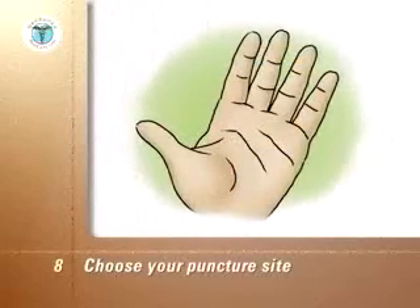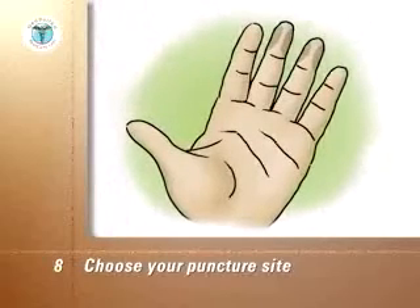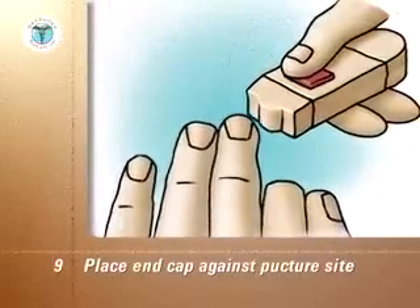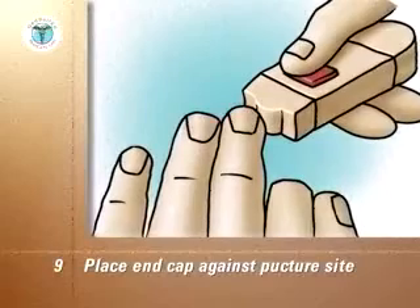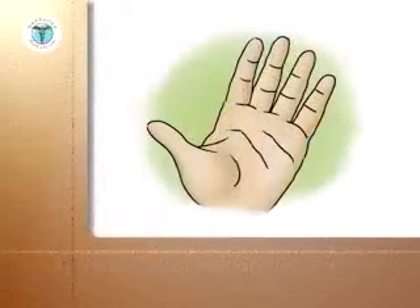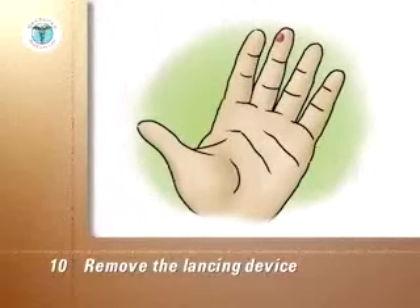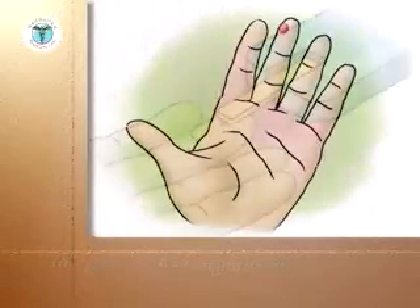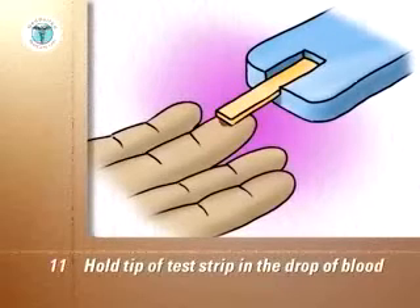Choose your puncture site. The sides of the end segment of the finger are the best sites. Stroke down the finger to push blood toward the puncture site. Place the end cap firmly against the chosen puncture site on the side of the fingertip — the more pressure you use, the deeper the puncture. Push the lancet release button without moving your finger or the device. After the puncture, remove the lancing device. If a drop of blood does not form on its own, stroke down the finger towards the puncture site without going as far as the site itself. Hold the tip of the test strip in the drop of blood until the meter tells you the test strip is filled, usually by beeping.